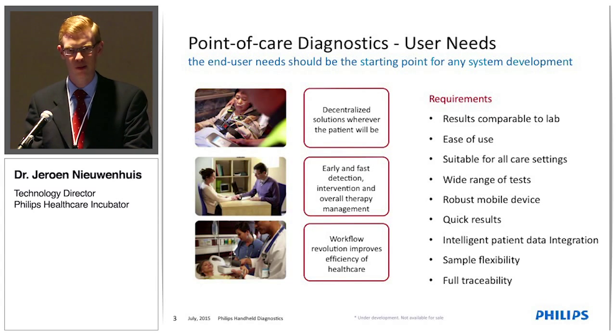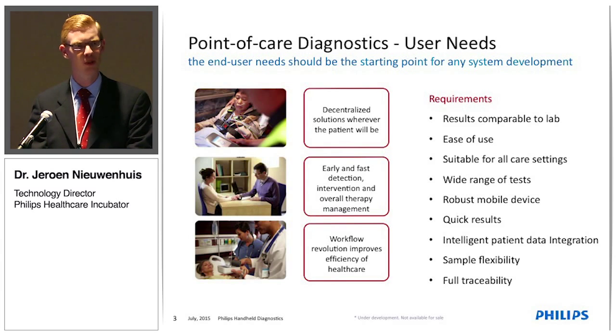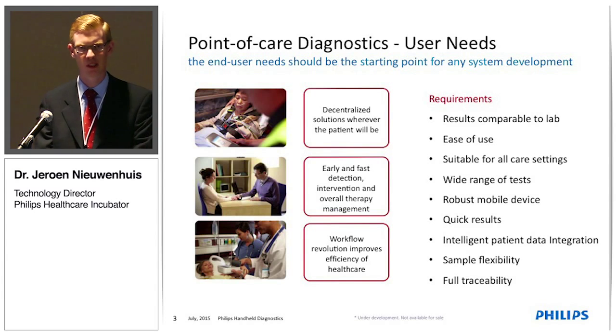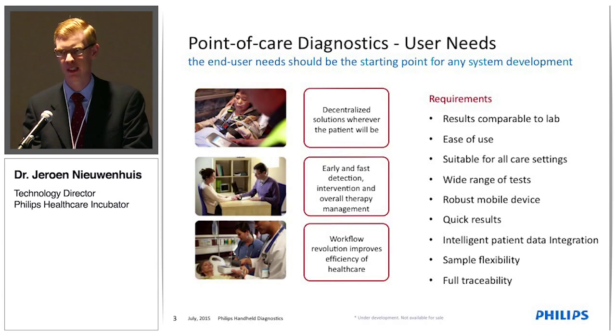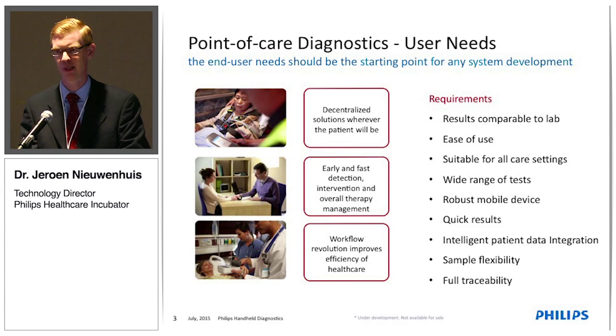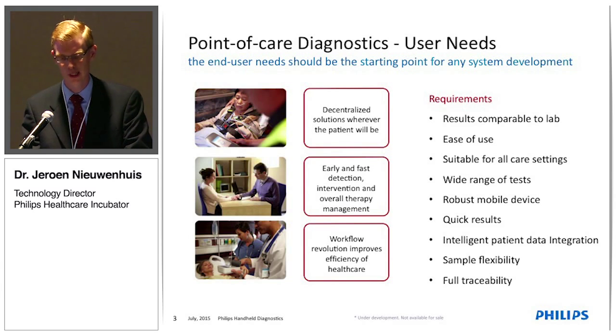The third element that was also mentioned quite a lot was that there's a need for a point-of-care system that supports a wide range of tests, because if you compare the point-of-care systems with the central lab devices, you can directly see that the menu that's offered on these devices is much smaller. And what that means is that if you want to do a lot of your tests on a point-of-care system, you need to manage multiple devices that you all need to maintain, you need to calibrate those, and you need to train all the nurses to work on these systems. So ideally, you would like to have a system that can address a broad range of parameters.